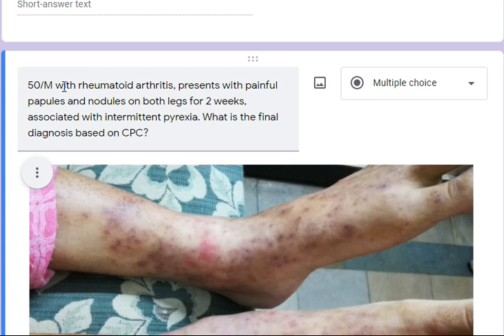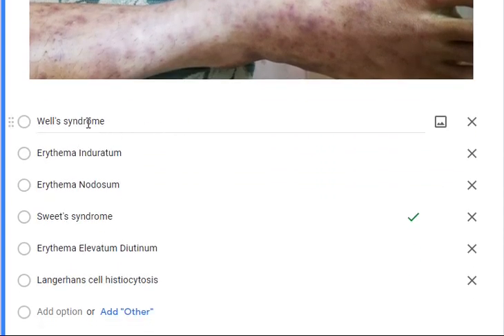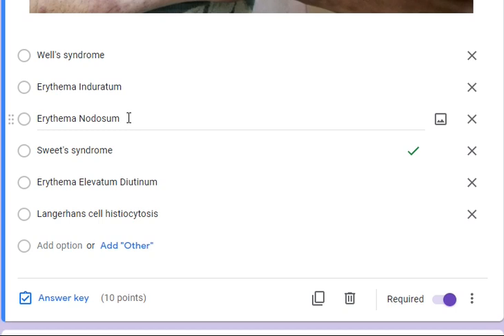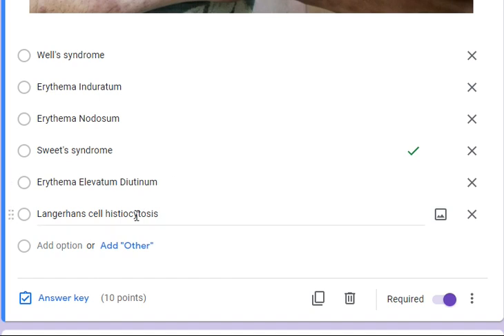Correlating with the clinical picture: this is a 50-year-old male with rheumatoid arthritis presenting with painful papules and nodules on both legs for two weeks, associated with intermittent pyrexia. Well's syndrome should be predominantly eosinophilic — ruled out. Erythema induratum is not associated with such a dense neutrophilic infiltrate. Erythema nodosum is predominantly a septal paniculitis without this degree of interstitial infiltrate. Erythema elevatum diutinum is a chronic leukocytoclastic vasculitis with fibrosis. Langerhans cell histiocytosis is easily excluded — no Langerhans cells are present.